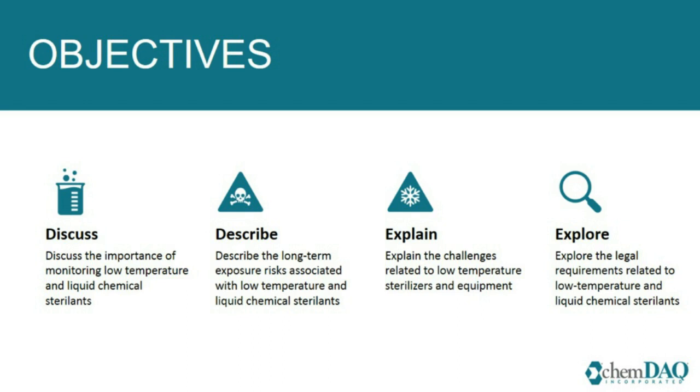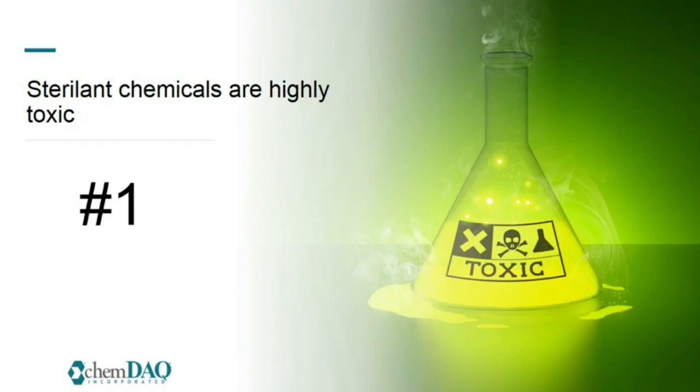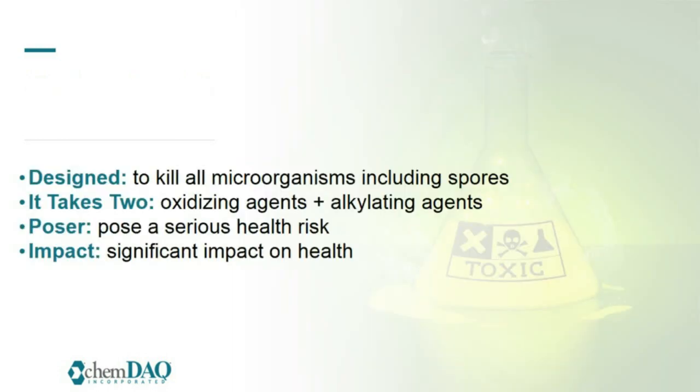So let's jump right into the topic. Number one on our list is that sterilant chemicals are highly toxic. They are designed to kill all microorganisms and spores. If they were not toxic, they would not be effective. There are two main classes of chemical sterilants.